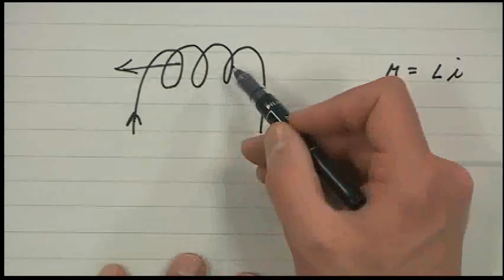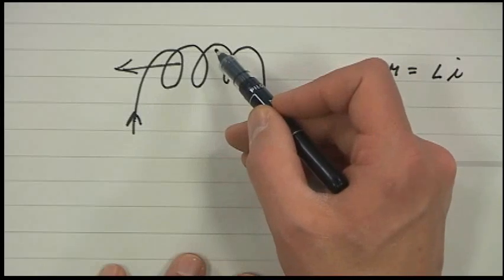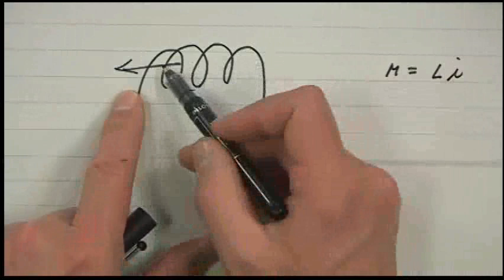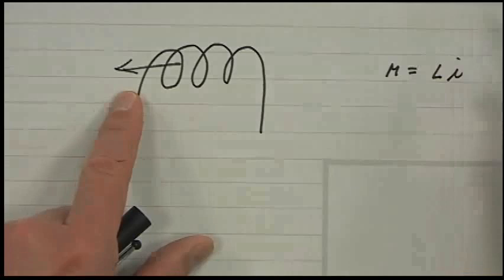And then this is designed so it's not a uniform magnetic field. It's a magnetic field gradient, and there are tricks to do that. So what will end up happening is that the magnetic field changes approximately linearly with position.